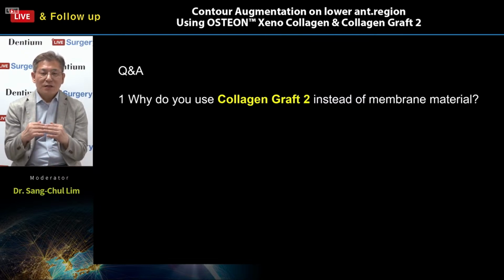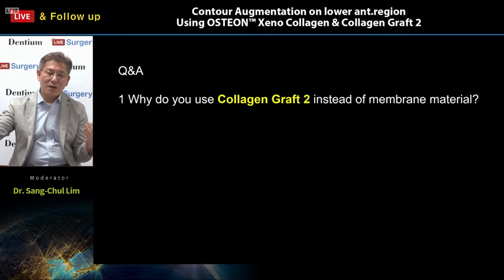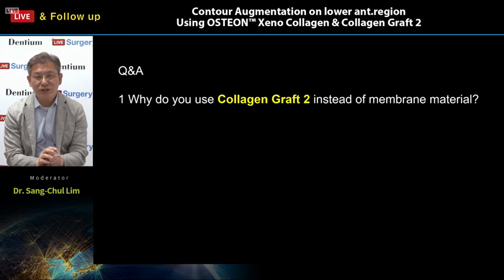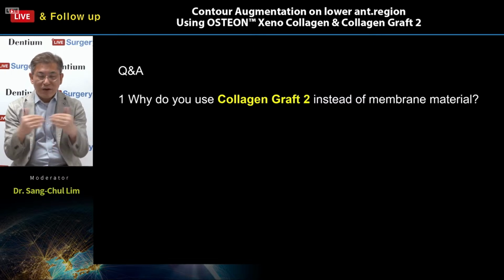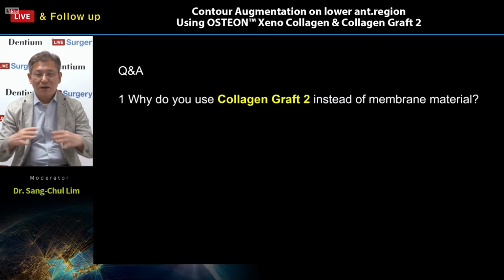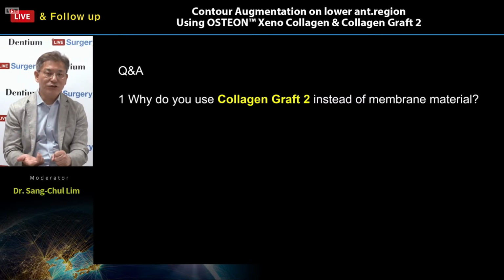So the mission of this membrane is the barrier function, from what? Actually, cells from the outside, fibroblasts and epithelial cells, want to invade the empty surface between the bone graft material. So this membrane's main function is the barrier and protecting the underlying bone grafting materials while they transform into newly forming bone. That is the main issue.